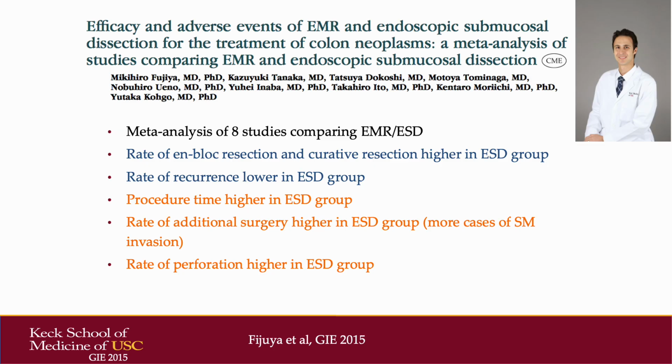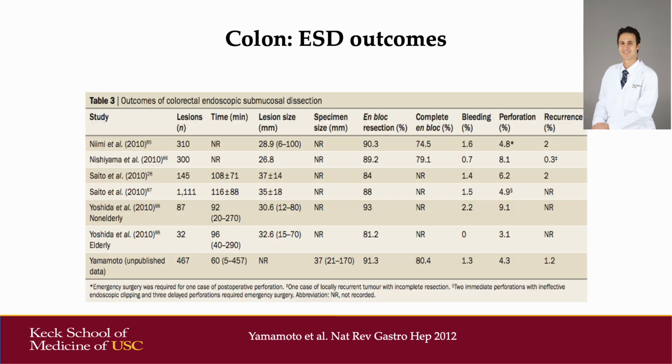There was a higher rate of additional surgery in the ESD group, and this was thought to be because there were more cases of submucosally invasive cancer that later required surgical resection, as well as the rate of perforation that was also higher in the ESD group.